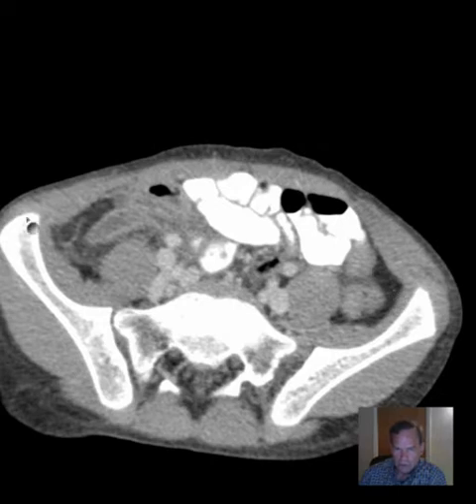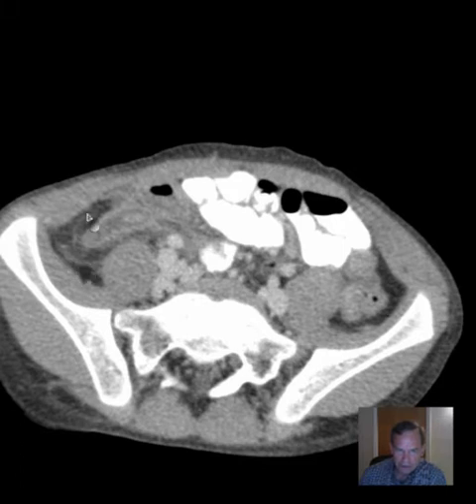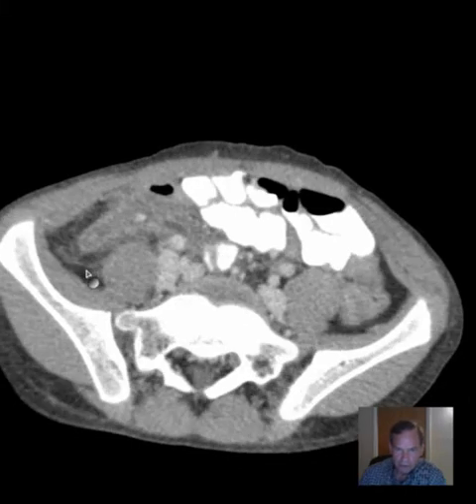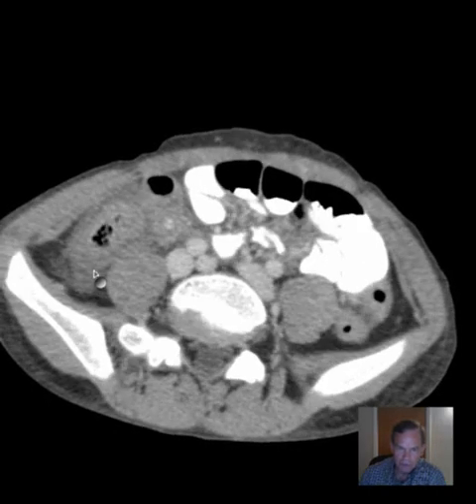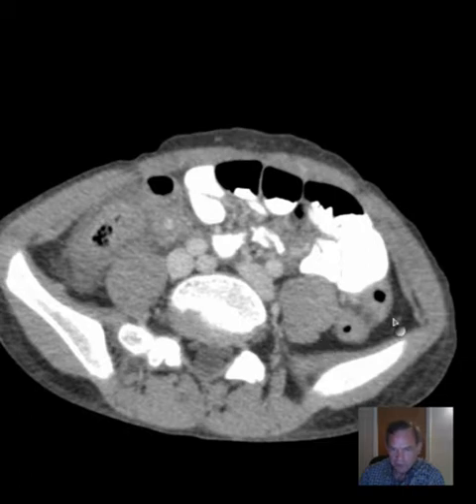Look over here and notice that contrast — this is what we're looking for. This finding of this line here, these little tiny linear opacities, this is what we look for when we think we might have an inflammatory process. Here again, that asymmetry of this indistinct appearance of the fat adjacent to the lower right colon in contrast to what we're seeing on the contralateral side.